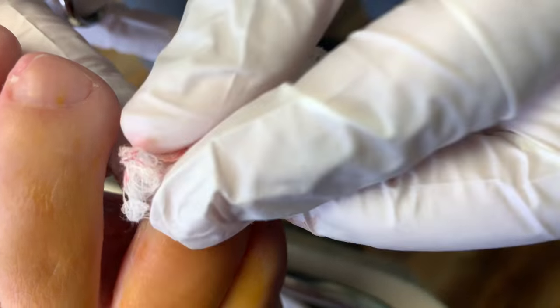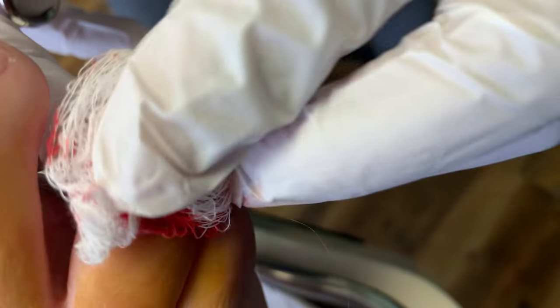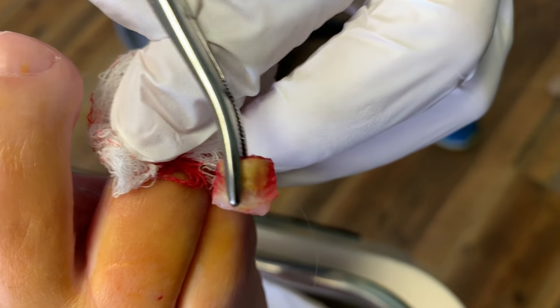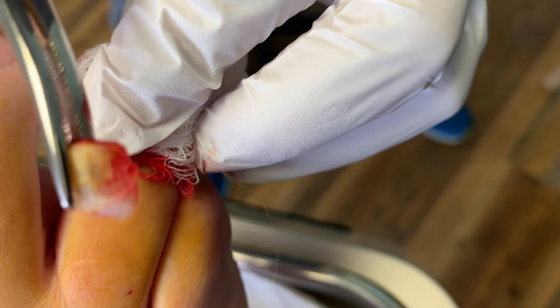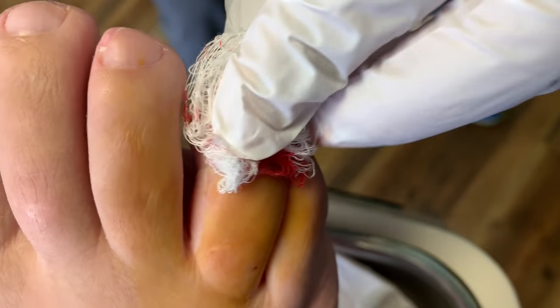Very little damage to the nail bed — I like it. Now, the key to this procedure is the aftermath. You can see the nail there — a nice thickened nail. It's going to be no longer. But again, the key is the aftermath and how it heals.